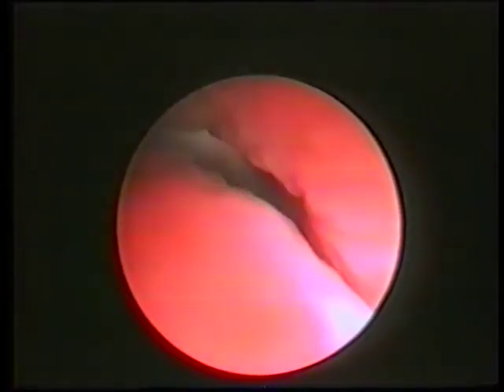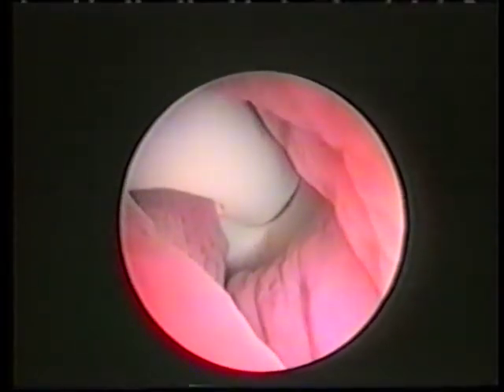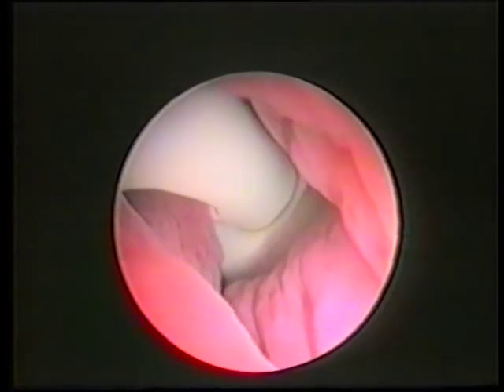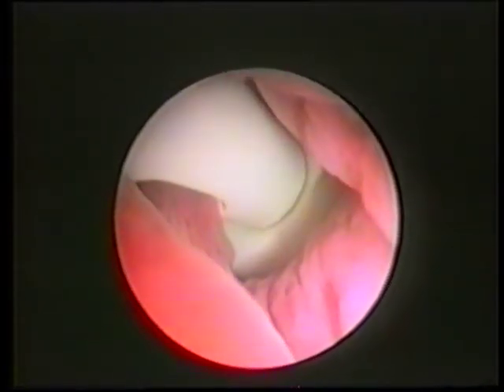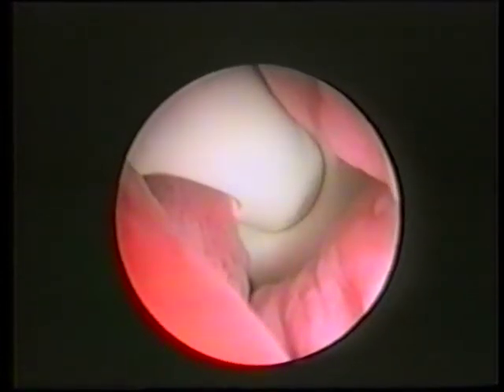Note how the mucosa is being sucked into the eye holes of the catheter, forming pseudopolyps which can obstruct the lumen of the catheter. This arises from the negative pressure which develops in the drainage tubing from the unbroken column of urine above the urine collection bag. If the vertical height between the bladder and bag is 30 centimeters or more, the suction effect can be dramatic.